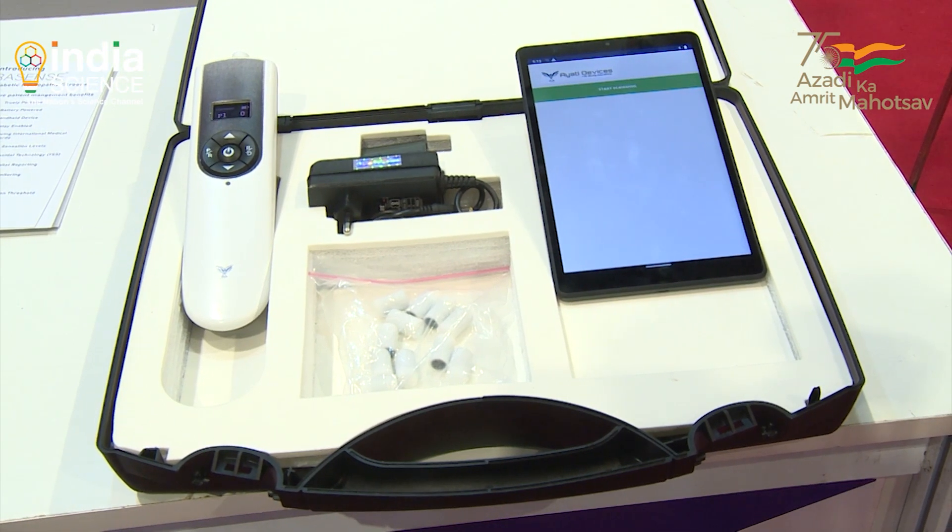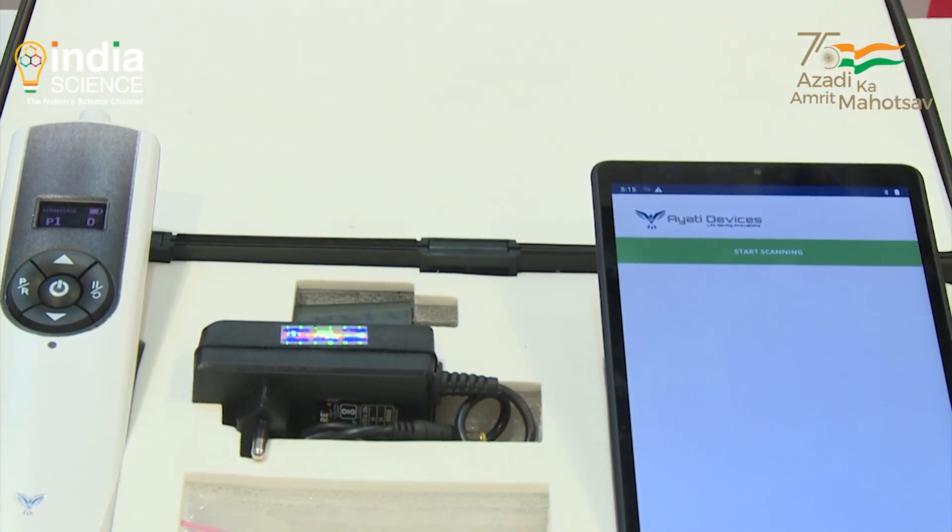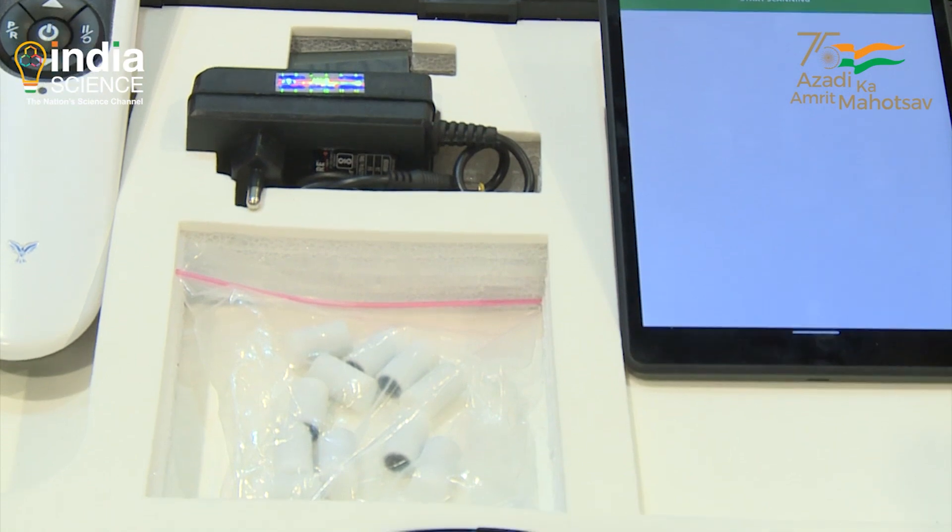We have already started distribution in Africa and the Middle East, and sooner or later we are looking for distribution in Europe and the US as well — after getting FDA approval. Diabetes is not only a problem in India, it is a worldwide problem.